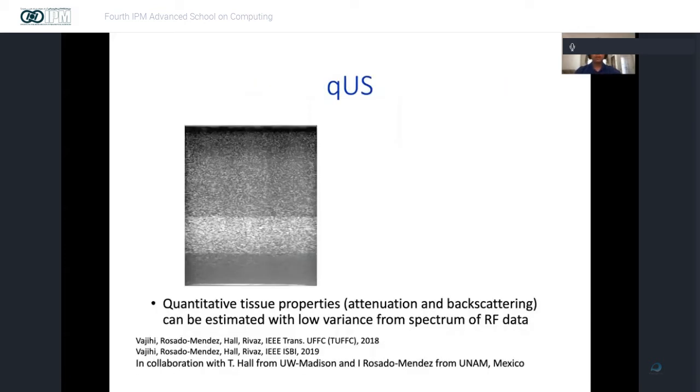So in collaboration with researchers in UNAM and Wisconsin-Madison, we proposed a novel quantitative ultrasound method that can extract intrinsic tissue properties.